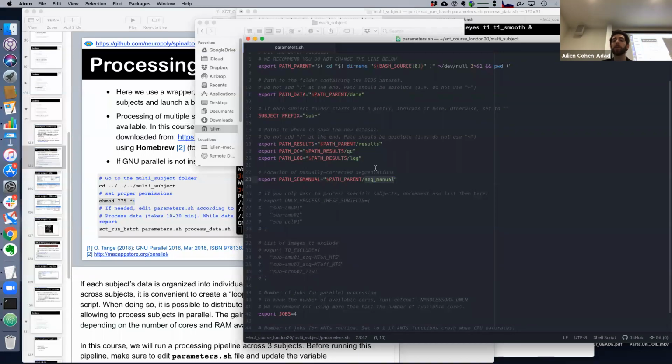And very importantly, we talked about some algorithms failing, and sometimes you have to do manual adjustment. How do you deal with manual adjustment in a fully automated pipeline?